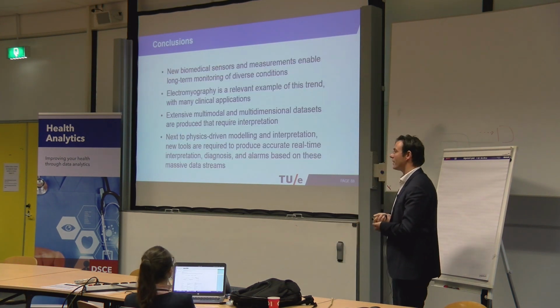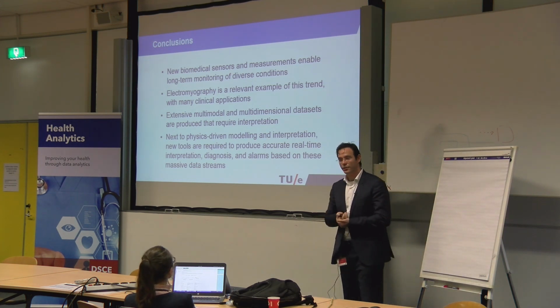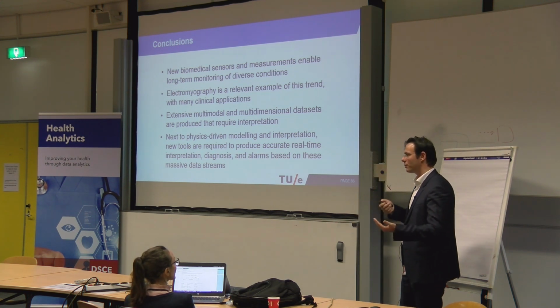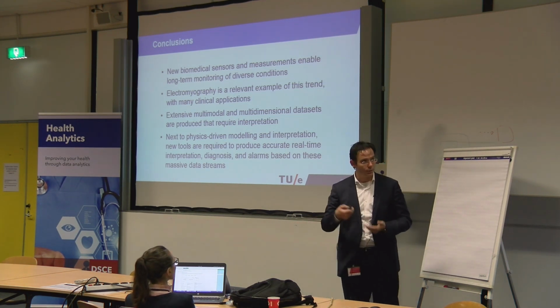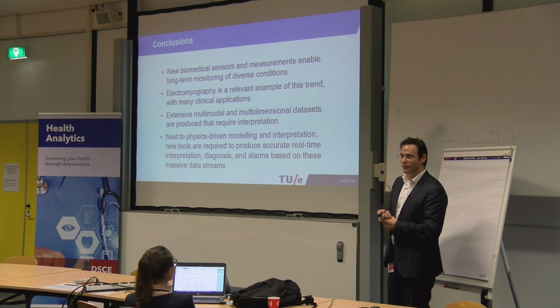Especially electromyography, I think, is a good example of that. It will produce a lot of additional data. These are even multimodal data, because we are also trying to acquire signals simultaneously from, for instance, accelerometry, in order to deal with artifacts. I haven't got time to discuss that, but that's also very valuable.